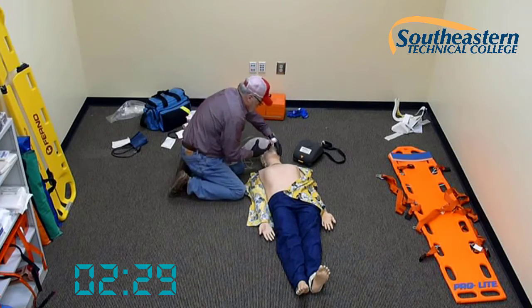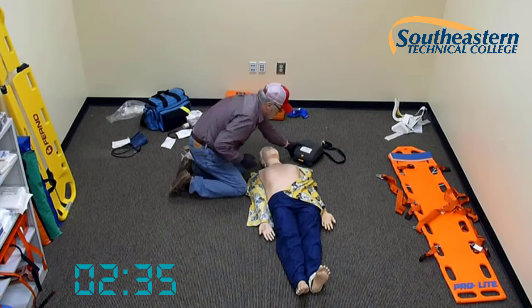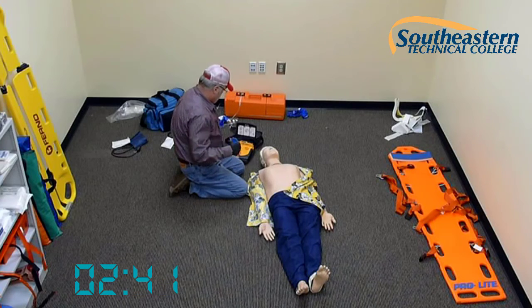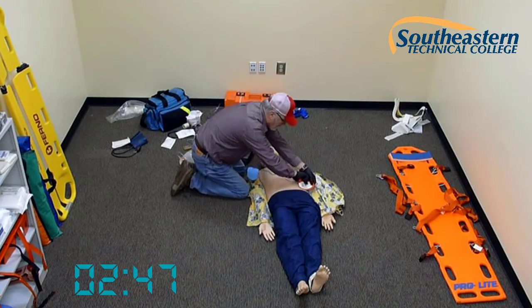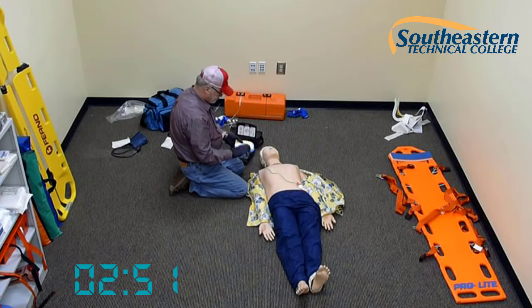I'll have my partner begin chest compressions. Chest compressions going while I get out the AED. As my partner is doing chest compressions, step 1, turn on the AED. Expose chest. Remove all clothing from patient's chest. Apply the pads while compressions are being continued.